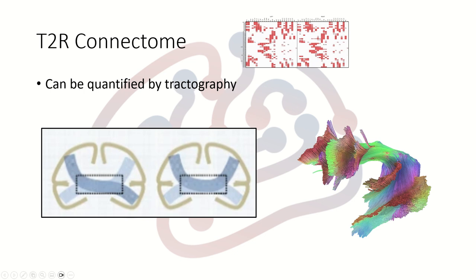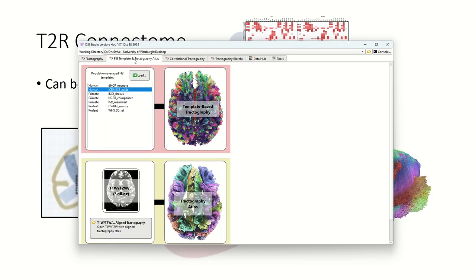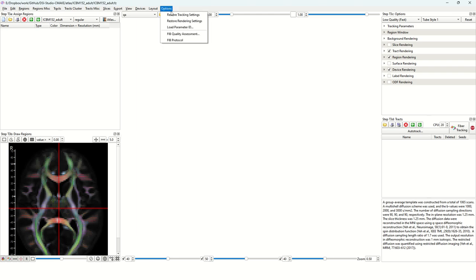So how to do this in DSI Studio? We'll use an example here. Let's start DSI Studio. It's starting the program. For illustration, we'll use the tractography template. We switch to the second tab and then open the human adult atlas.